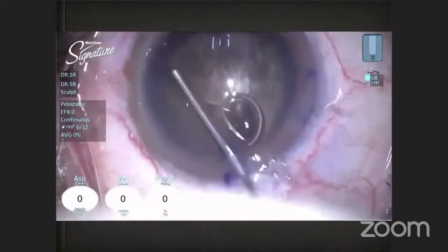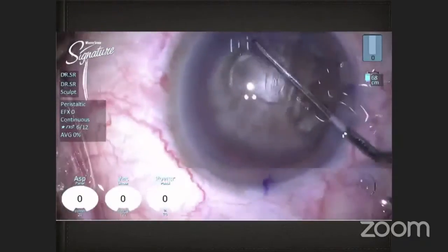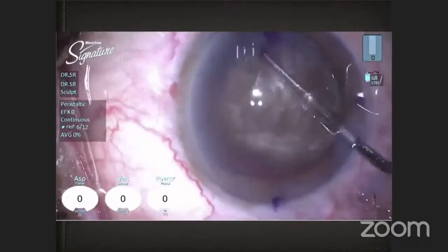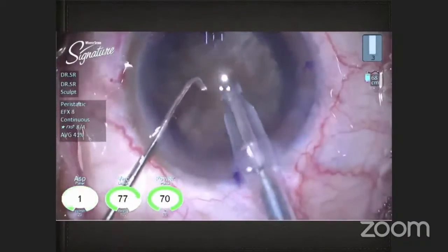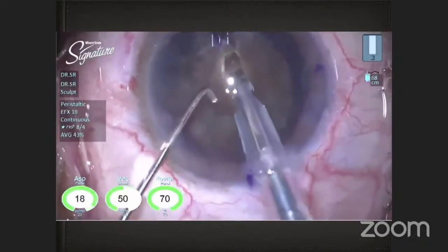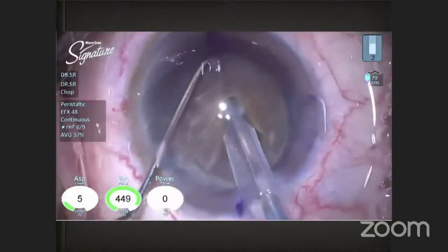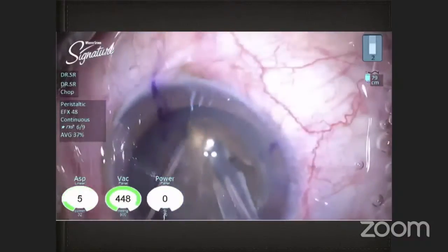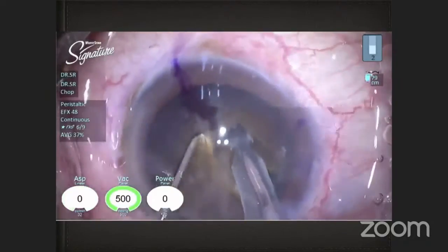Doing a gentle but multi-quadrant hydro is extremely important, as any aggressive movement of this nucleus can cause zonular dialysis in these cases. I do a central trench. Now, the length of the trench is not necessarily very important. It's the depth which is more important. But a central debulking always helps, as it provides more space. And it also helps you to occlude deeper so that your first chop can go right up to the crater itself.